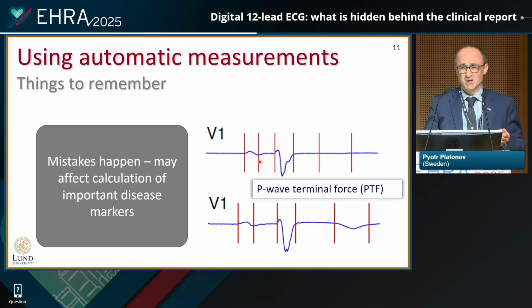Does it matter? Maybe not really if we are only interested in P-wave duration, because P-wave duration is from the earliest P-wave beginning in any lead to the latest in any other lead. But if we want to look at left atrial abnormality, for example, like here, then all of a sudden we are missing that completely. It may not be important if we're dealing with 1 million ECGs, but if we are dealing with 100 patients or 200 patients, then we would exclude these patients who do have or may have abnormalities that are associated with the disease. So it's worth checking.